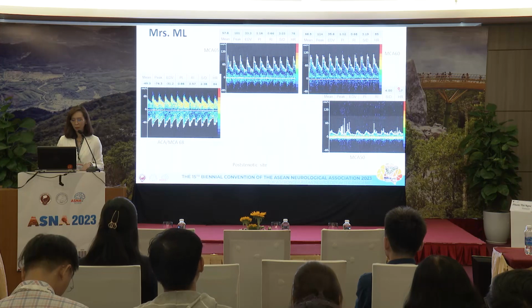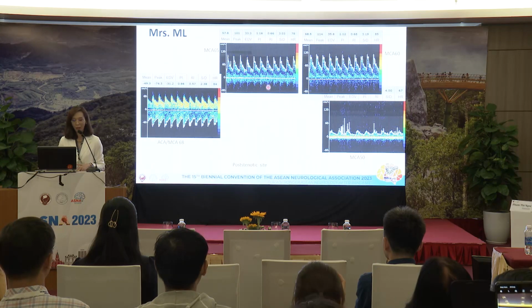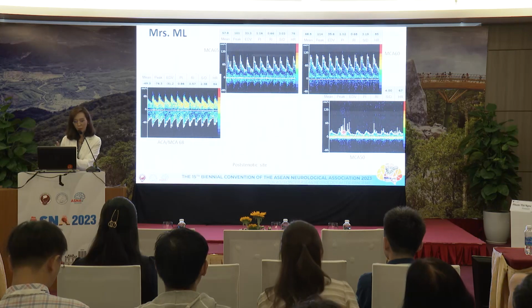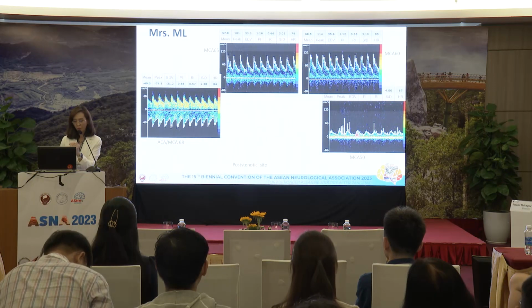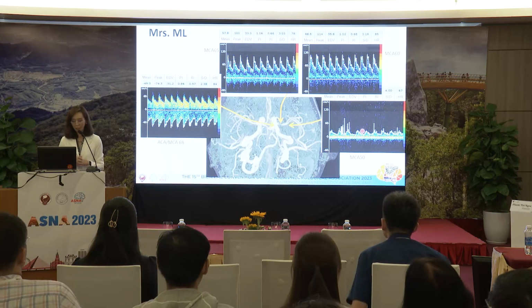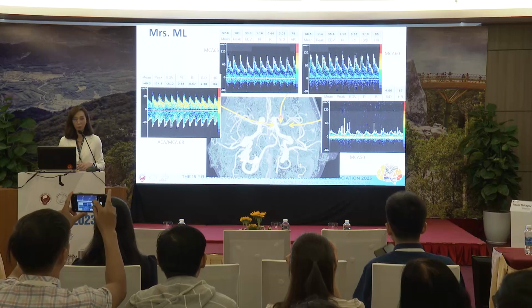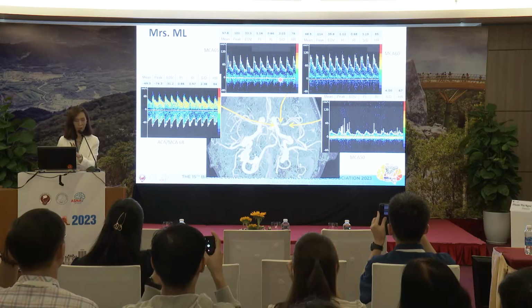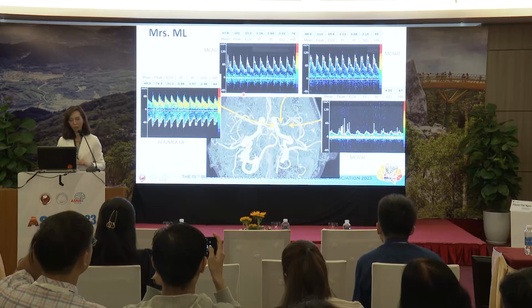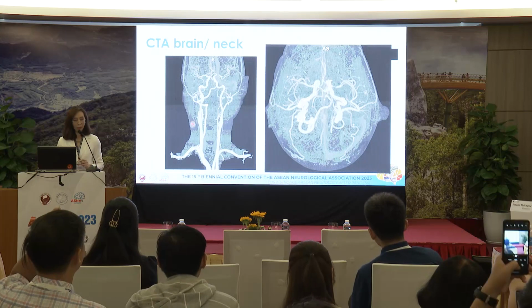So the probe is right somewhere over here. Getting deeper, you can see that this is ACA and this is MCA. And the velocity is very high in the MCA right at this point. And going near the probe, the velocity is down and the wave looks dampened or attenuated. So this is actually what the CTA looks like. At the stenotic site, usually we'll get a very high velocity, and we should measure that and see how high the velocity is, and you can just go to the criteria and look for it. So this patient is having MCA stenosis, and the carotid is fine.